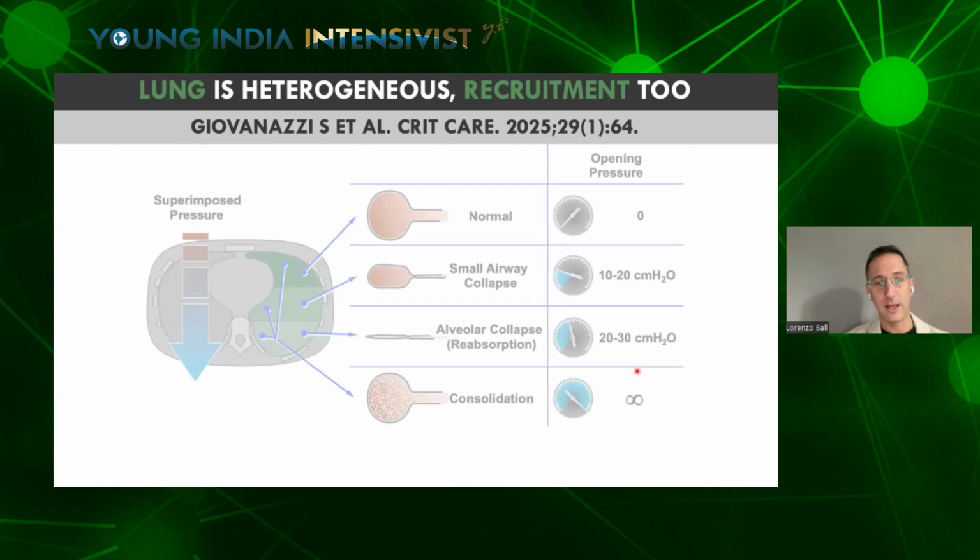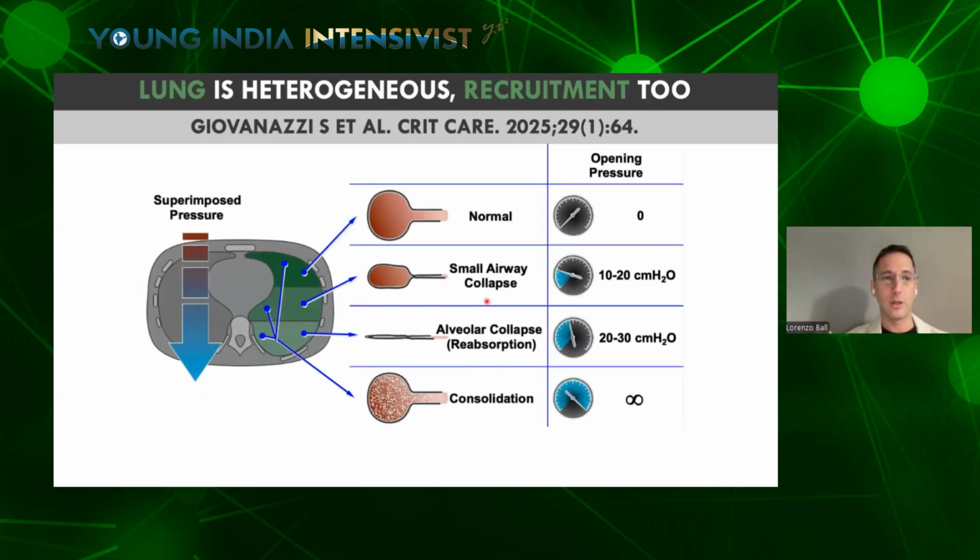And of course, we have to think about the fact that we ventilate the patient through one single tube. But when we use imaging techniques, we get information on how ventilation is distributed regionally inside the lungs. If we inspect the lung from the ventral to the dorsal region, we will have areas of normal aeration in which I need nearly no pressure to open them. I will have intermediate regions with a small airway collapse and other mechanisms leading to an opening pressure around 10 or 20 centimeters of water. I will have regions of complete alveolar collapse, necessitating pressures up to 30 centimeters of water.